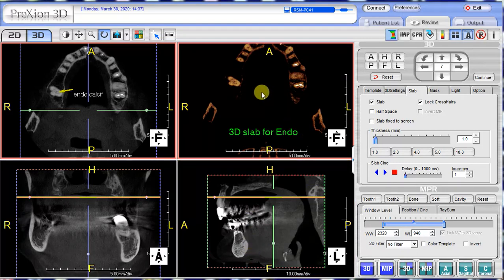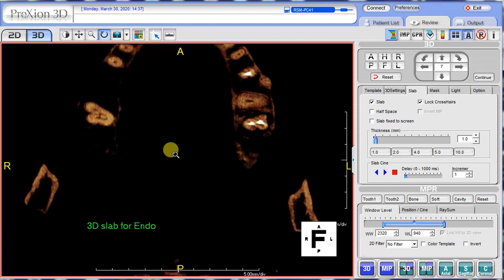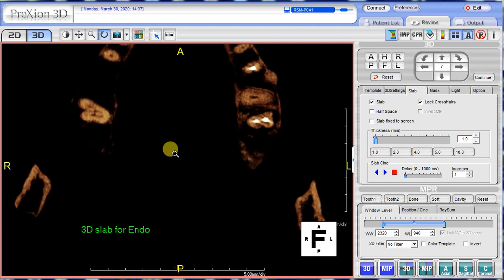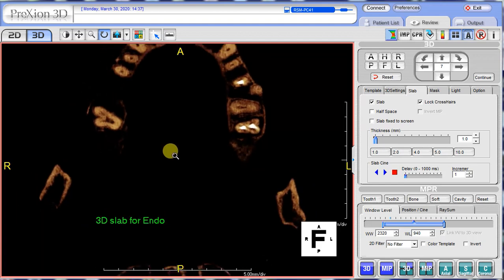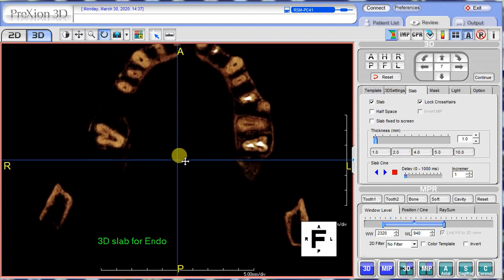You can double-click on the 3D image itself to make it a little larger. Or if you press the middle wheel down, you can zoom in and out. Right-clicking re-centers.